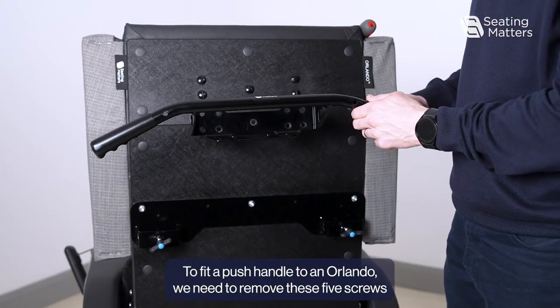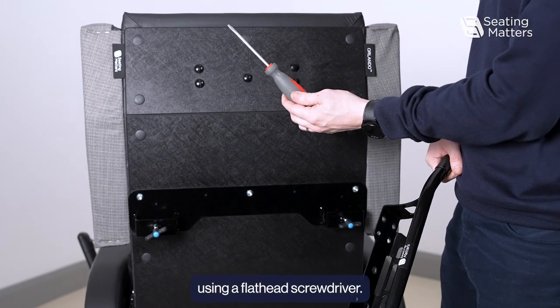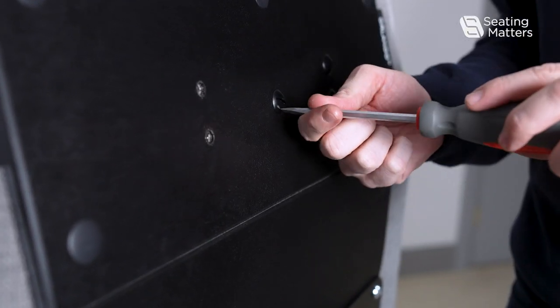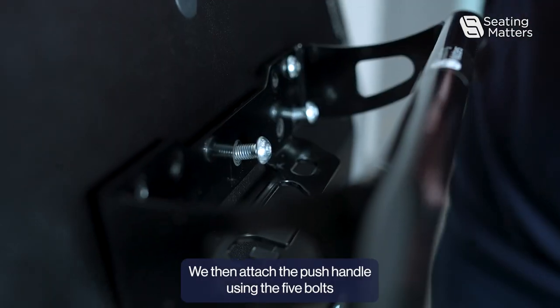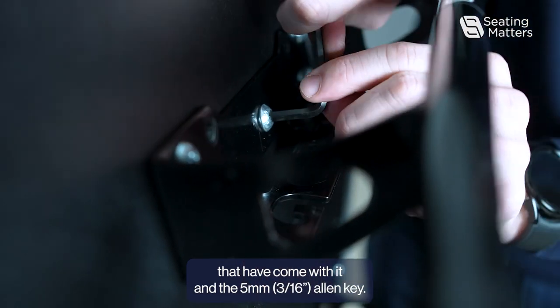To fit a push handle to an Orlando, we need to remove these five screws using a flathead screwdriver. We then attach the push handle using the five bolts that came with it and the five millimeter Allen key.